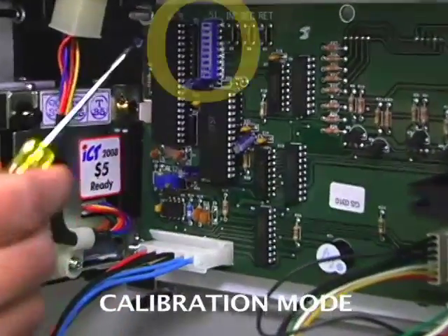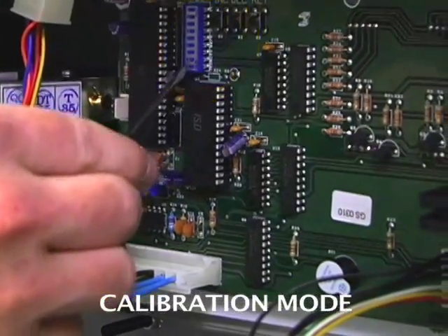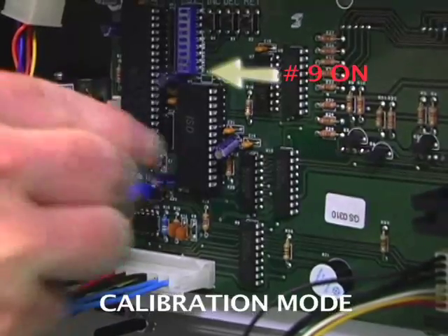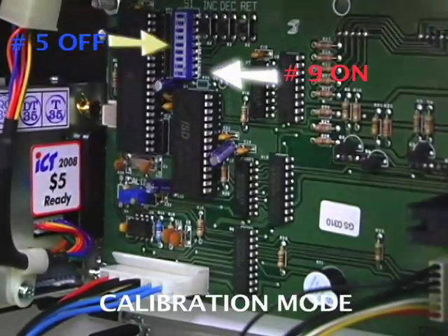On the main electronic board, there are 9 blue dip switches located on the left side. We are going to switch 9 on and switch 5 off. Now the machine is in calibration mode — that's 9 on and 5 off.